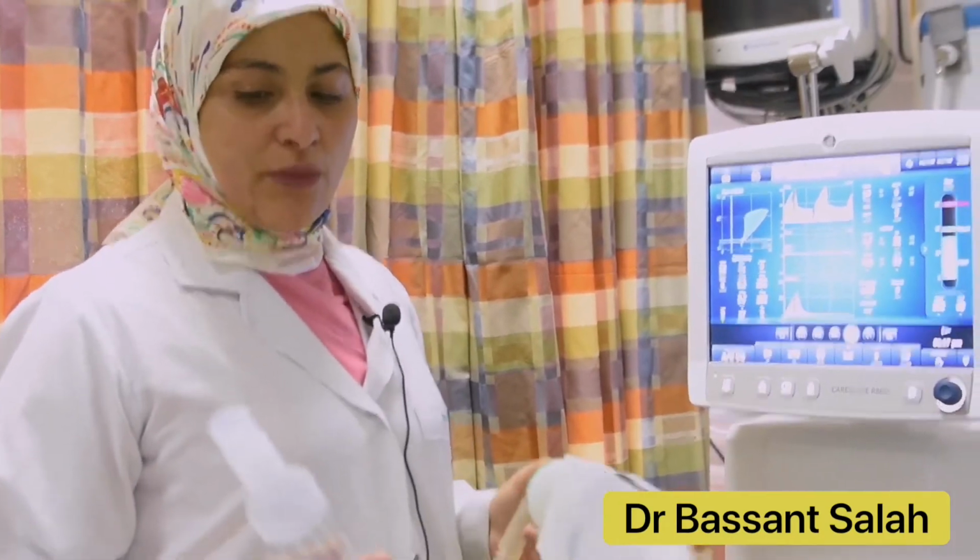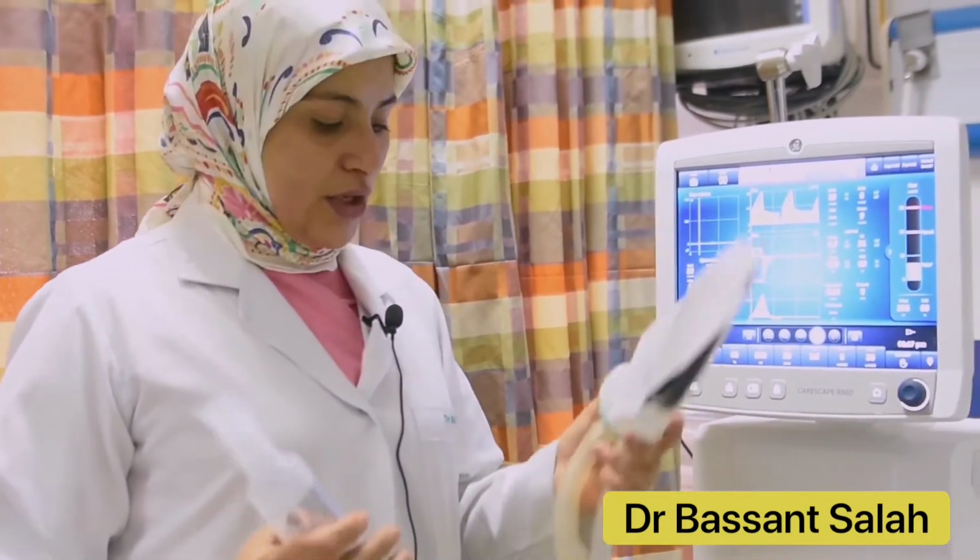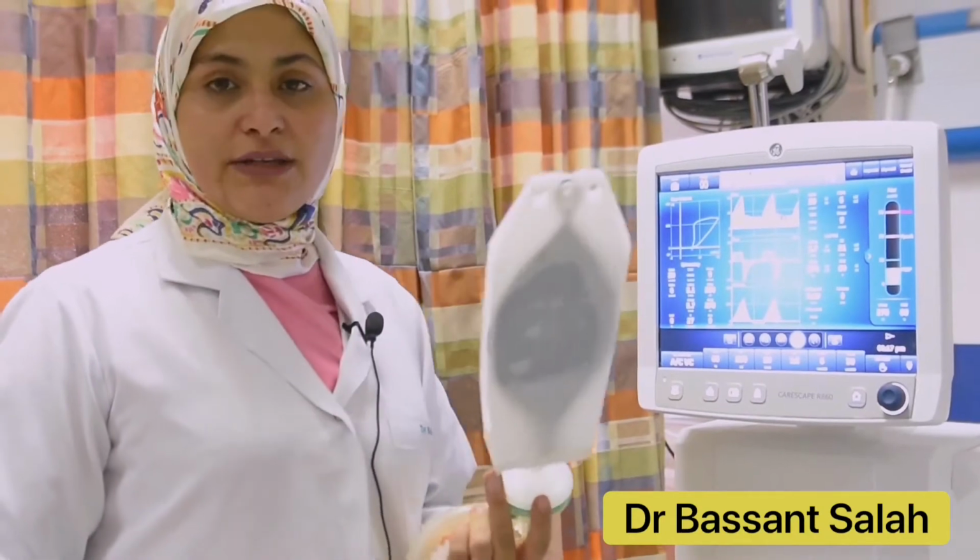Everyone. Today we are going to talk about nebulization in a mechanically ventilated patient. So here we are connecting different nebulizers. We have the MDI, or we have a jet nebulizer, or a vibrating mesh nebulizer. Also we can use the ultrasonic nebulizer.